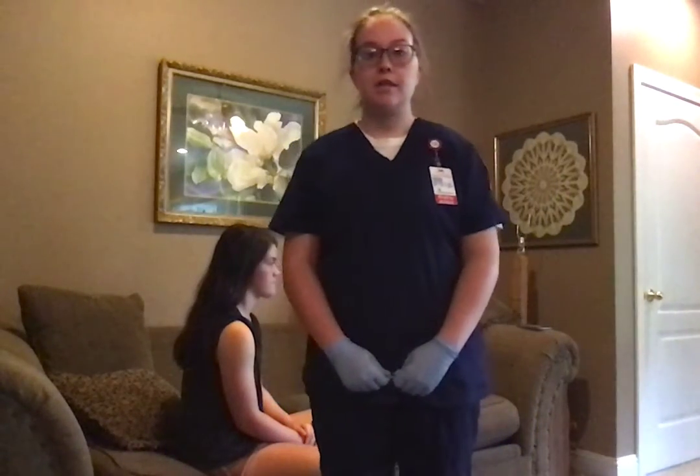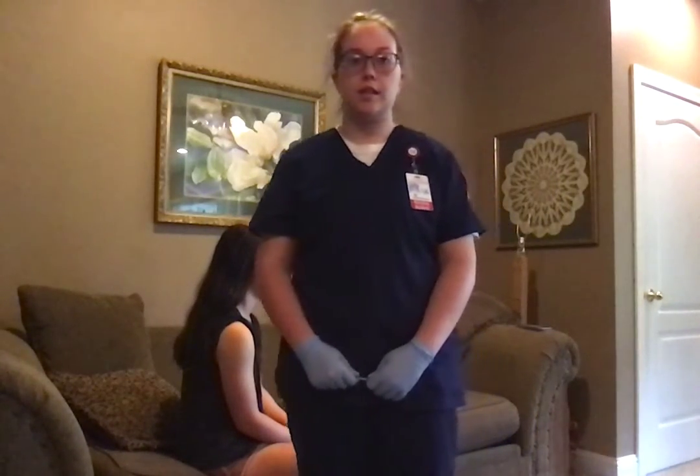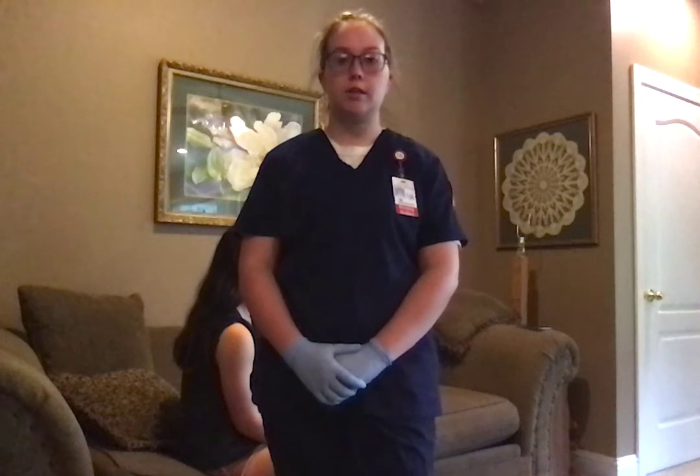My name is Tabitha Montier. I'm a nursing student at the University of South Alabama, and today I'm going to talk about and demonstrate various injection sites for intramuscular, intradermal, and subcutaneous injections.